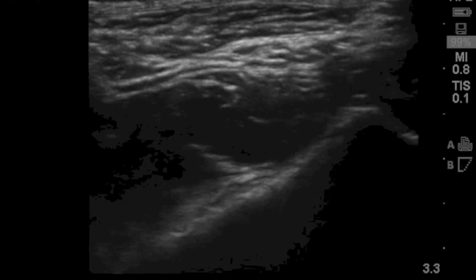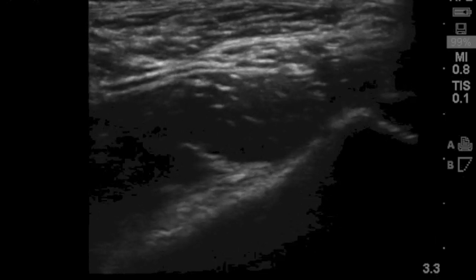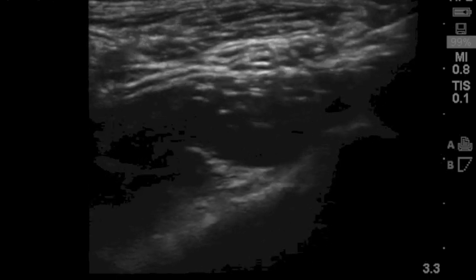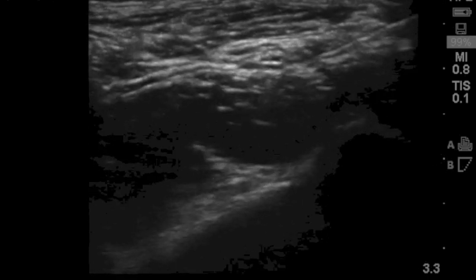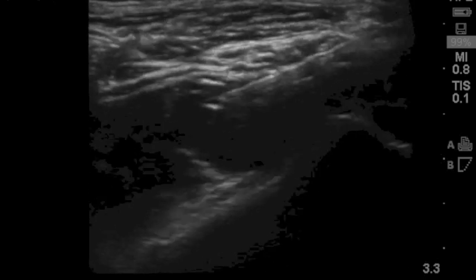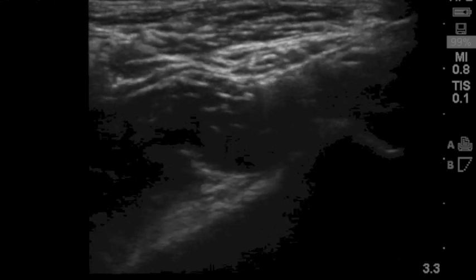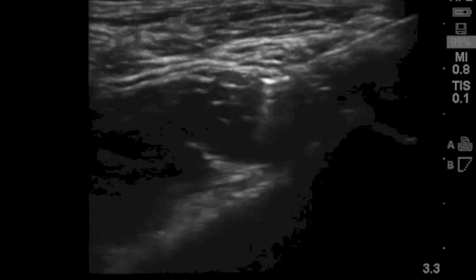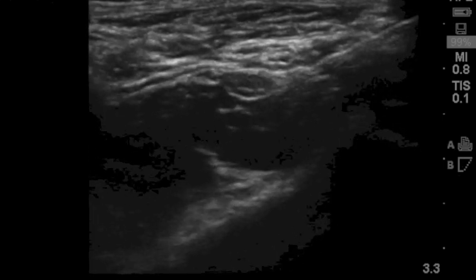In this view, you can see the actual live ultrasound. From the right side of the screen, you can appreciate the needle that is traversing the sartorius muscle and has just now penetrated below the fascia iliaca plane. You will see once the tip of the needle position is confirmed, local anesthetic injectate will begin right now.